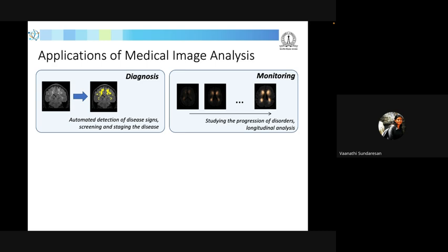A second is monitoring. Let's say there is a disease that we are monitoring, for example, a tumor. What can we understand about the time progression of the disease? At two different time points or multiple time points, how do these tumor lesions vary? The volume changes, the shape varies, and how these things are captured in this particular modality. How can we use this modality to understand the changes in the disease lesions?